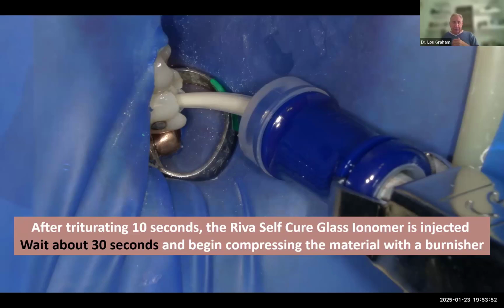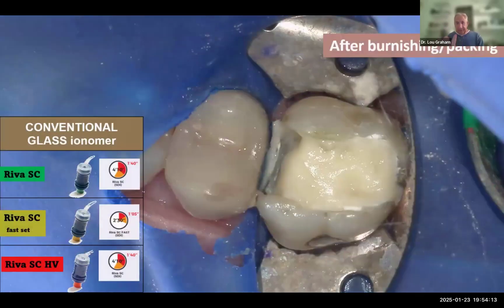I usually wait about 30 seconds. And I like to wait about 30 seconds because the material goes through a hardening process. This is the Self-Cure glass ionomer. So after about 30 seconds, I begin taking my composite plugger and just packing it down. This is the initial shape I want to get to.